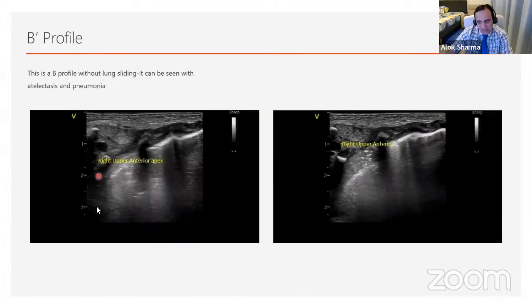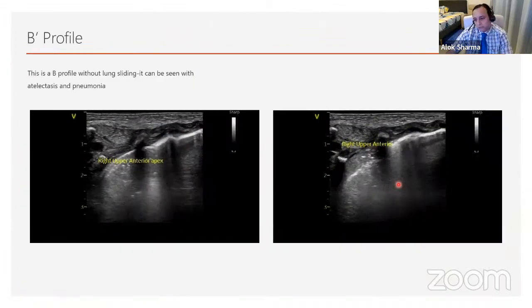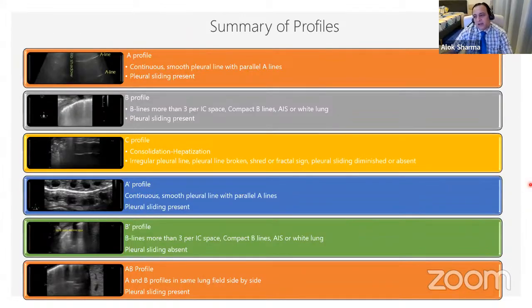Mayank, I'll explain C lines again. Don't worry. We'll talk about lung pulse and static bronchograms. We have discussed it previously. Yep, pretty much like CFAM. You're looking at it at one point of time. So the raw EEG would kind of be the M mode, whereas the combination of everything is what you see on the amplitude integrated EEG.